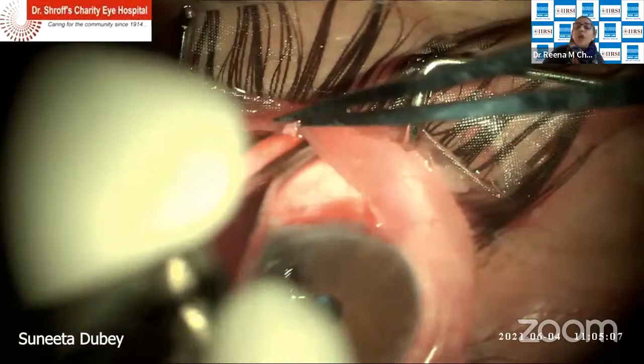Once we come to how to make the scleral flap and how to suture, my technique of suturing becomes a little different, because with Ologen I want my trabeculectomy to filter a little more than my usual endpoint with anti-metabolites. Ologen does really well if you take specific care during the surgery. I place Ologen under the conjunctiva after completing the scleral flap, as a substitute for an anti-metabolite. I never combine it.